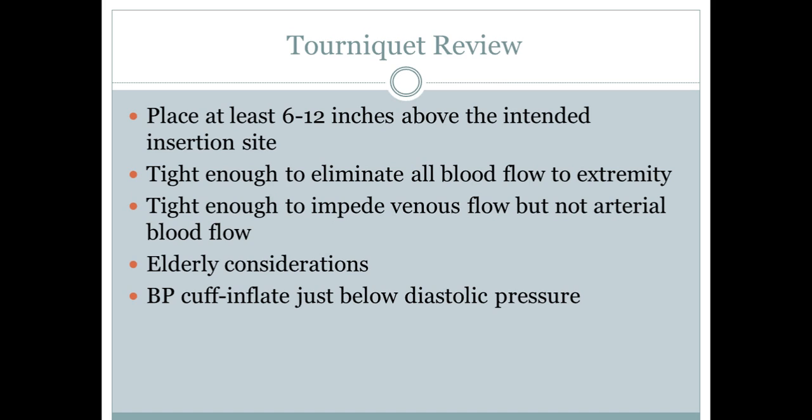There might be times when you need a blood pressure cuff. And then the question is, well, how far do I pump that cuff up? How do I know? Just inflate it right just below the patient's diastolic pressure. So you might want to take their blood pressure before, or just kind of use a baseline of what their blood pressure has been. But I'm still a big advocate of just getting it prior so you have the actual number at that exact time.